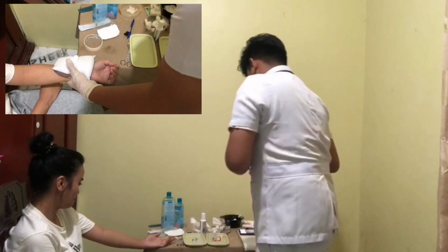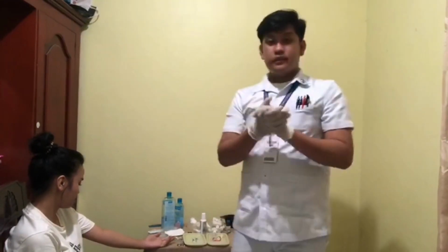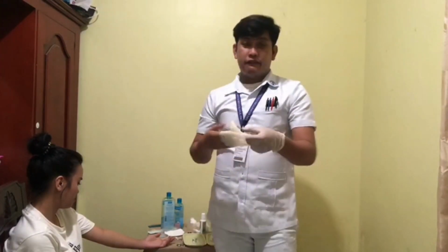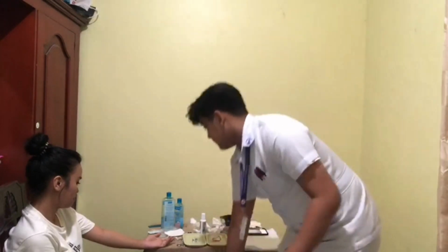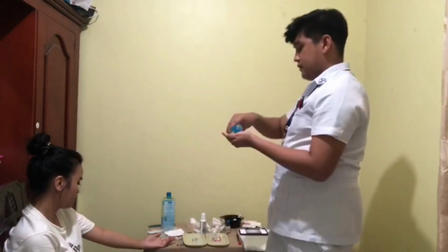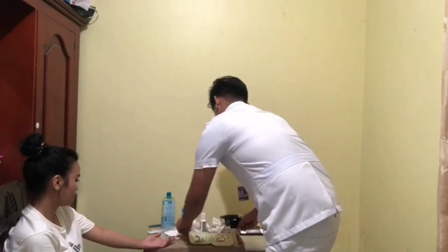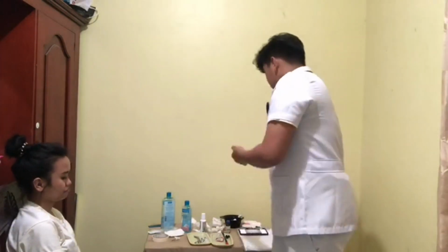Okay. And then after that, we'll now remove our gloves and do hand hygiene and aftercare for our materials. So now we'll document all relevant information to keep records. So this includes the medication given, the time, route, and dosage, and the reaction of the patient.